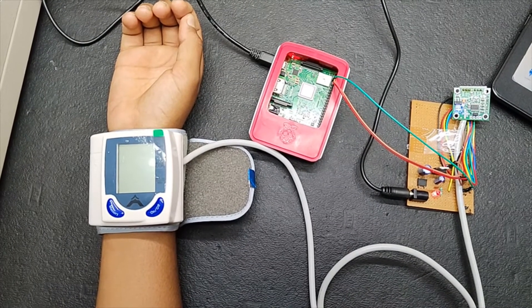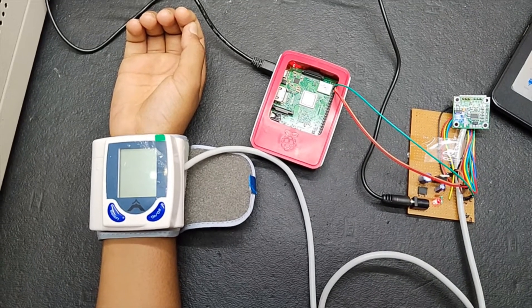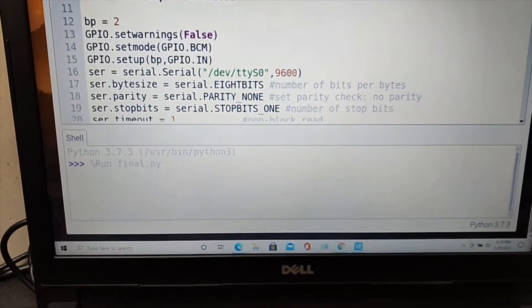Hi, this is a BP monitoring system using Raspberry Pi. Python code is running on the Raspberry Pi.